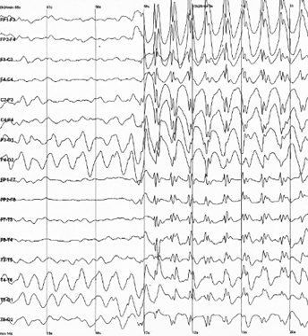Fetuses in the third trimester and newborns display two common brain activity patterns: discontinuous and trace alternate. Discontinuous electrical activity refers to sharp bursts of electrical activity followed by low-frequency waves. Trace alternate electrical activity describes sharp bursts followed by short high-amplitude intervals and usually indicates quiet sleep in newborns.